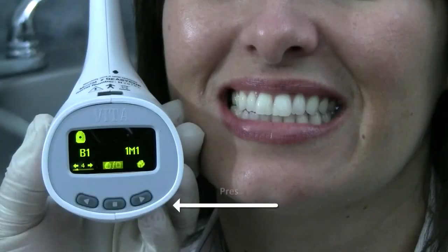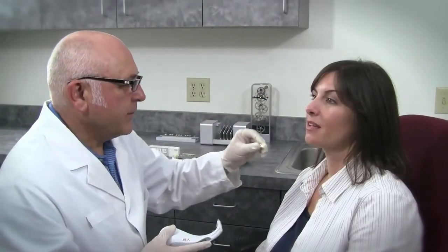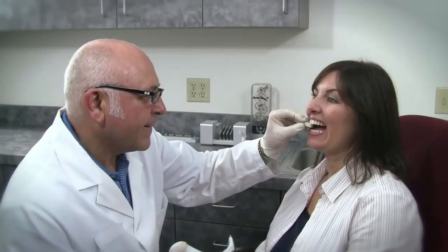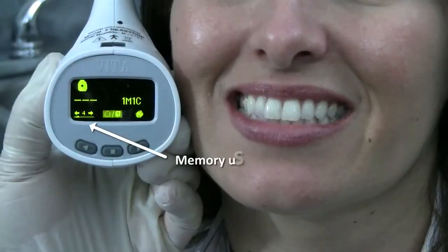We can take a shade of a patient and at any time you can opt to see the optimal block for that patient. You can do this also after the patient is gone, because the data is collected in its 25 individual shade memories.